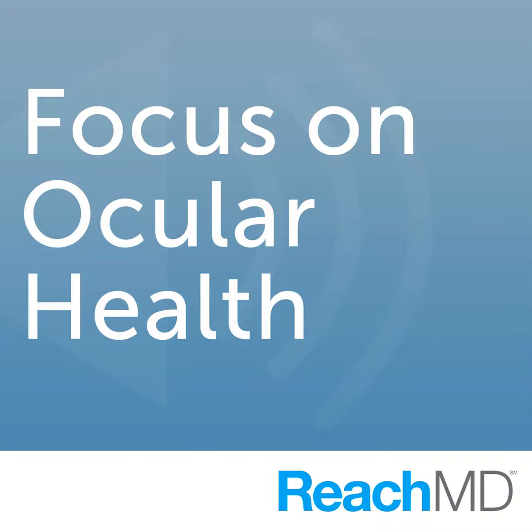And in following a patient who's been treated for wet macular degeneration, if the fluid has absorbed and then comes back on another visit, this is an indication for further treatment, and the OCT is a way to follow this? Yes, it's a very precise way. It's very easy for the patient because they don't have to have an invasive examination, and it lets the doctor know right away what the situation is in terms of the degree of leakage and whether a patient needs retreatment.